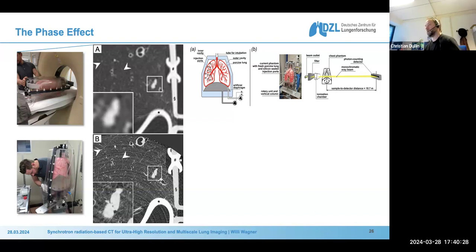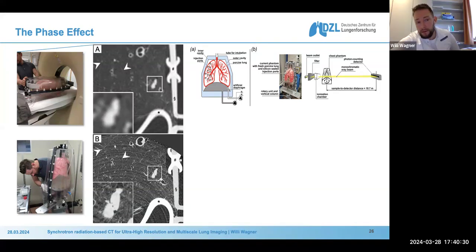That's true, Christian, but we did put it into the clinical CT scanner. It has an automated dose adaptation, and the dose that we measured in there, or the scanner actually used, was very well comparable with the in vivo situation in patients. But there's something to it. You're absolutely correct. It has to be repeated with the new phantom, which is simulating soft tissue and bone absorption too.